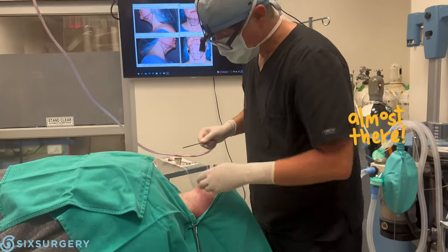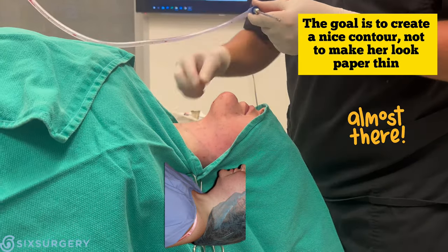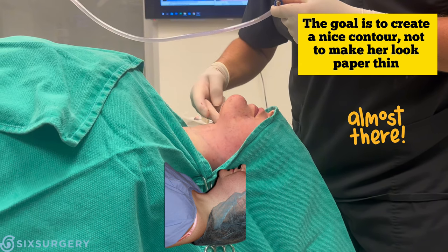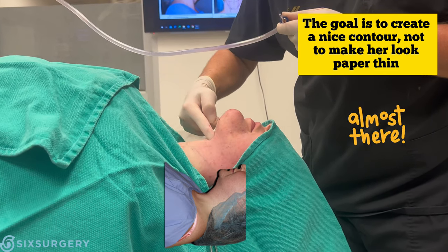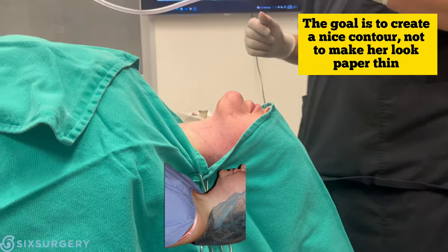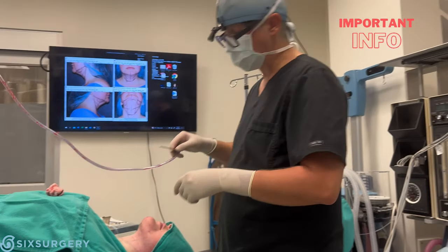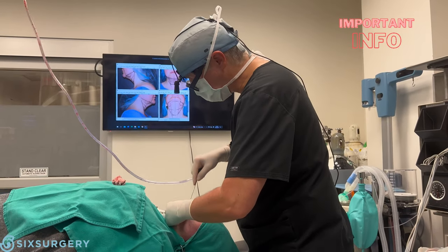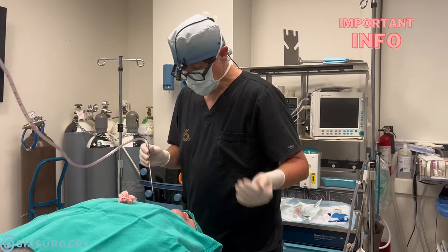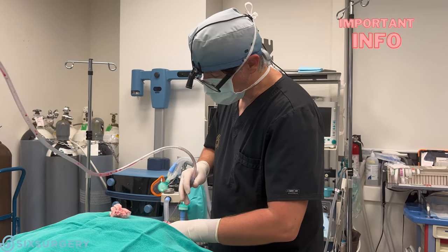Two hours later, we're almost done. I've achieved a nice contour. I'm going to pinch the skin — there's not much fat left. I'm going to leave some fat underneath to give a nice contour, but this is about as thin as it can be; we're down to the floor of the mouth and can't go any further. Some people want a really sharp edge, but this is the anatomical limit. The freezing lasts about six to eight hours, so she'll be home when it wears off. Please take your pain medication even if you're completely pain-free, so it's on board before the freezing wears off — pain medication works better when it's already on board than when it's chasing pain.